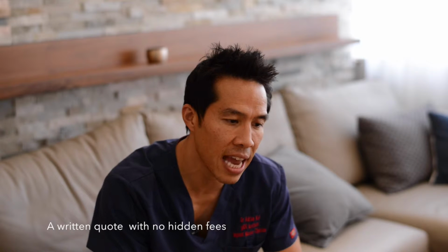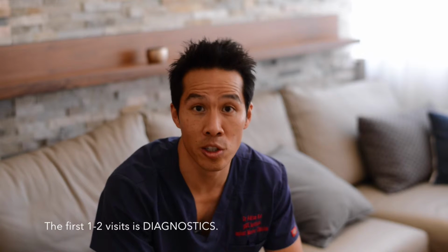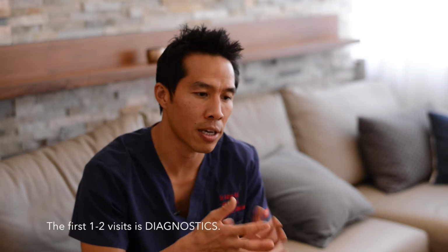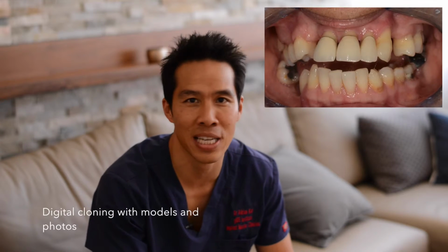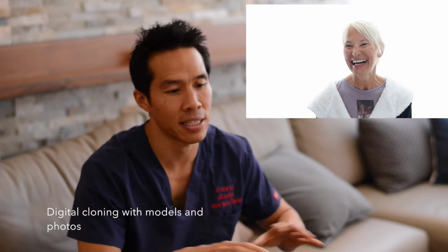If the patient is happy with that quote, that's when they organise appointments to get the all-on-4 surgery completed. The appointments that are most important are usually 1 or 2 diagnostic appointments. At the first diagnostic appointment we collect data, meaning we take models of the patient's mouth, and we take photographs and videos. We then start to use those models and photographs, and really what we call it is 3D cloning or digital cloning of that patient.